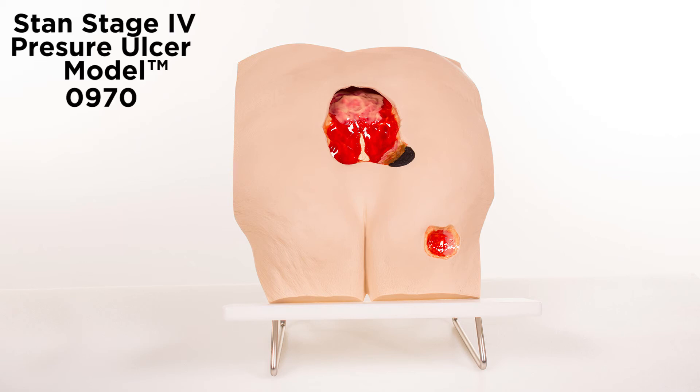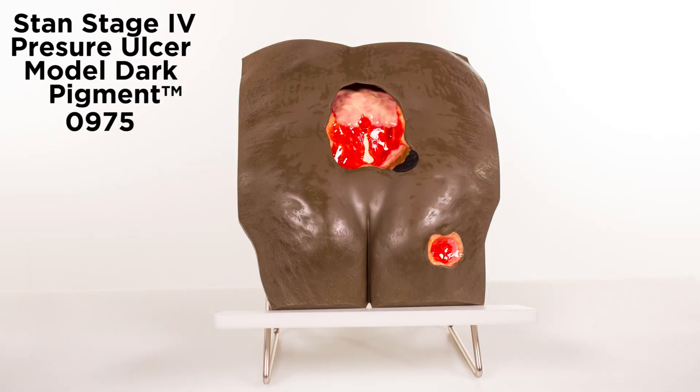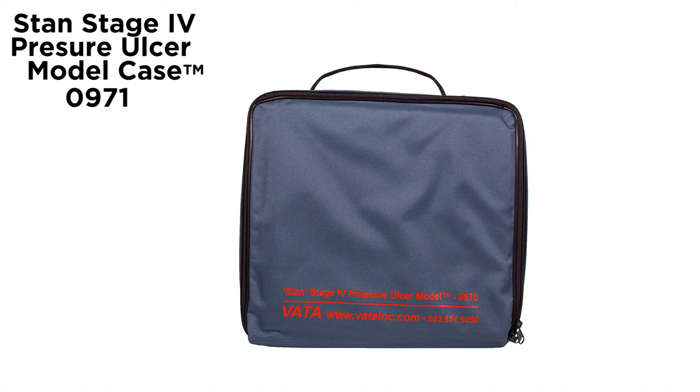Stan's Stage 4 Pressure Ulcer Model is available in lightly pigmented and darkly pigmented colors, and an optional carrying case, Model 0971, is available.